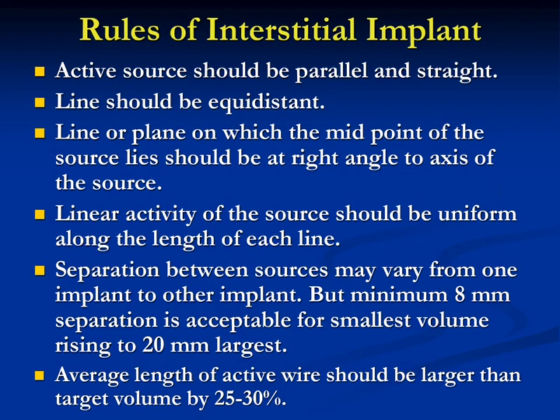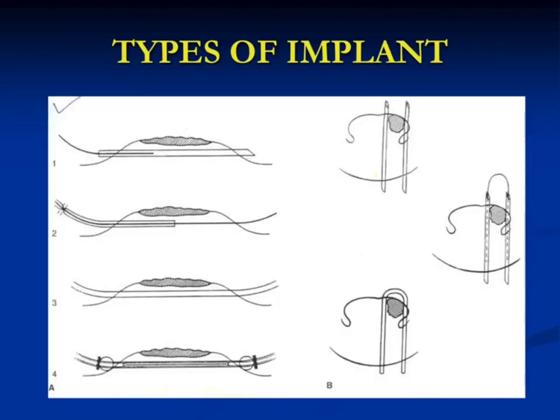So which one is to be used? A vertical implant requires the same tumor length, a large number of catheters, and also carries a potential risk of causing a neurovascular injury because it is directly inserted, but that does not happen in the horizontal.